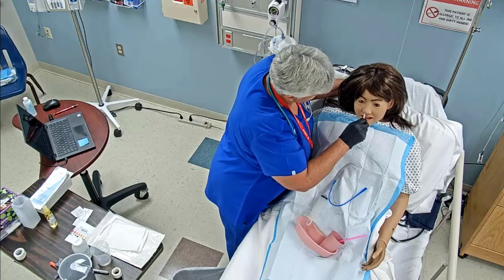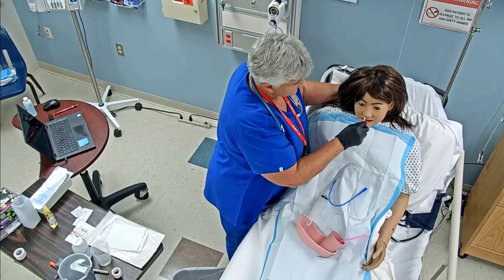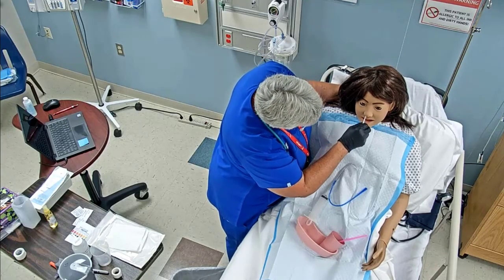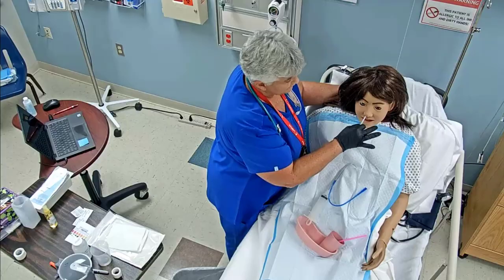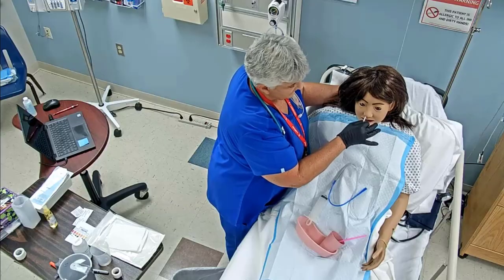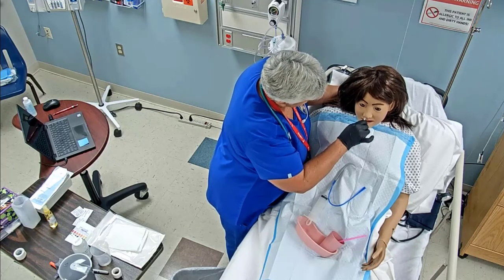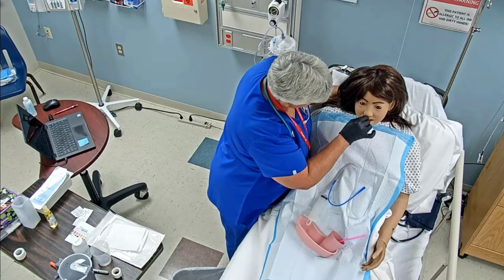Now, another note is if you start coughing, gagging, choking, showing signs of respiratory distress, cyanosis, maybe you can't talk to me, if that's the case, I would stop and remove it, and then I would look to see, according to the policy, how many attempts I can make before I need to call the physician. But she's not gagging, she's not having any respiratory problems, and so we're going to continue to advance our tube. Okay, every time she takes a gulp and a swallow, we're advancing that tube.